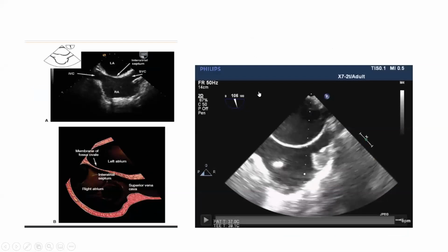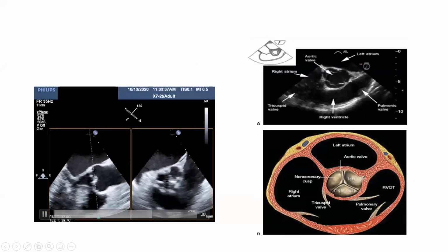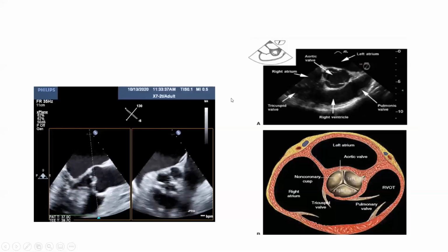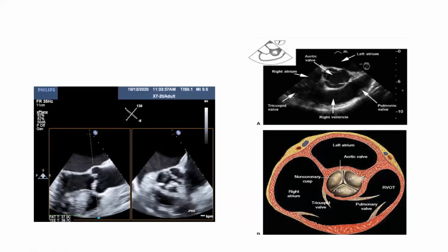I have it. I don't have it here. How do I get the short axis again? I will tell you from here. I will go back from 0, from 120. I will go down to 45. And when I went to 45, how do I get the anterior? I said clockwise. Do clockwise rotation.